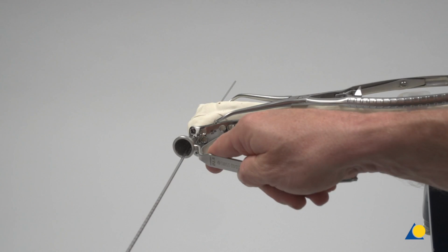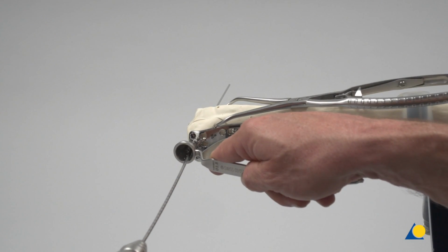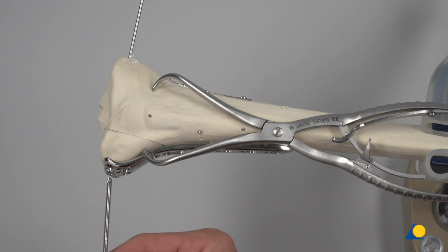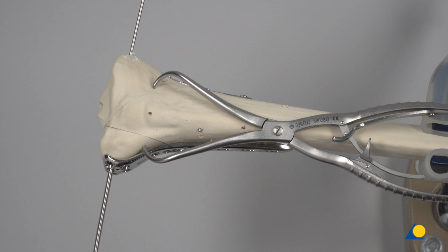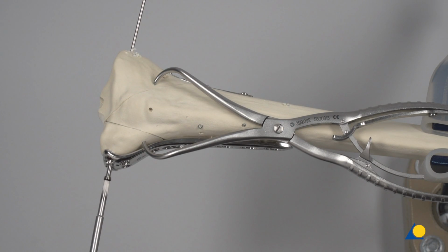The screw insertion steps are repeated, and here a 70 mm long 3.5 mm VA locking screw is inserted into the remaining rafting plate hole.